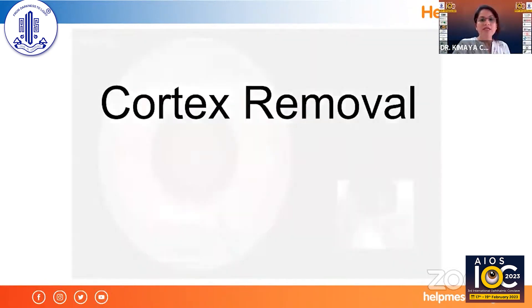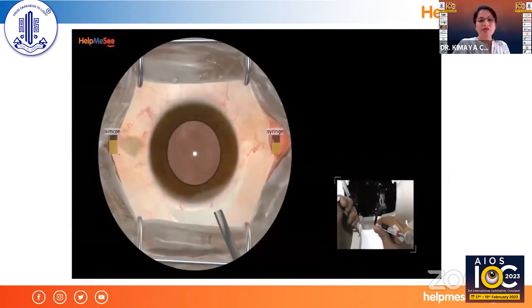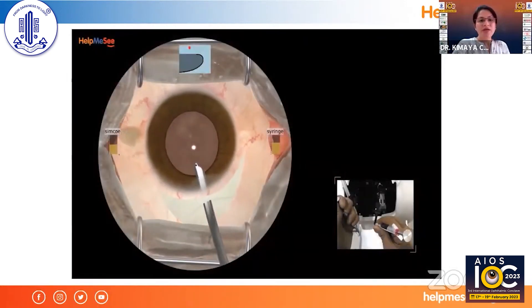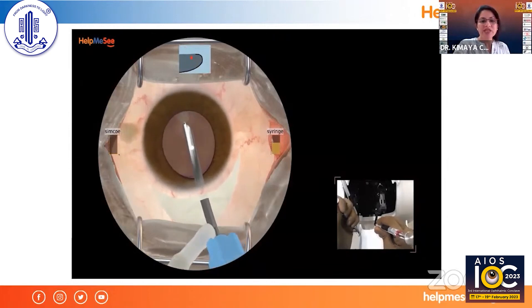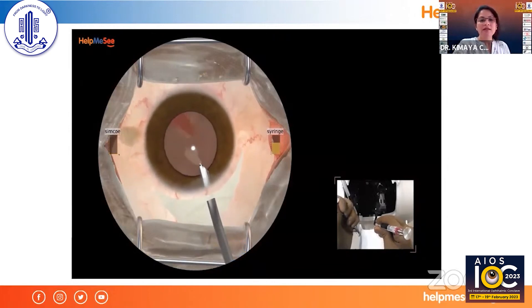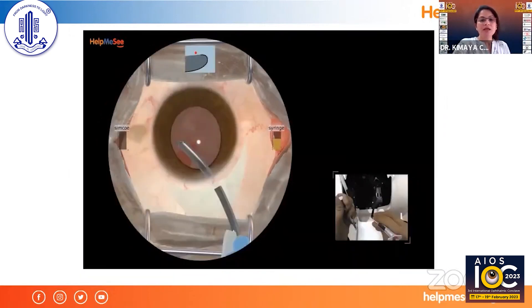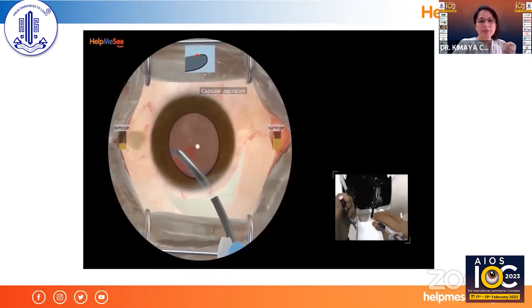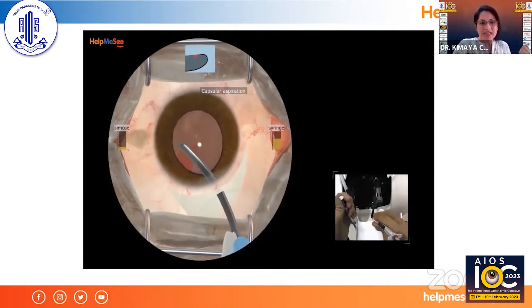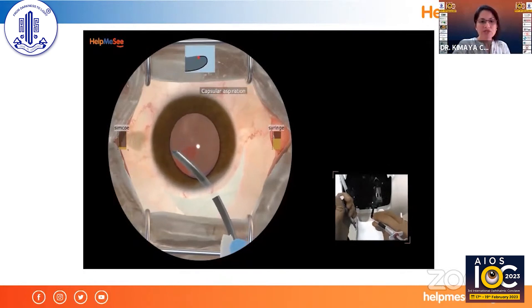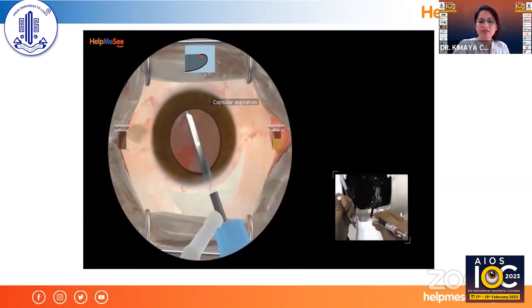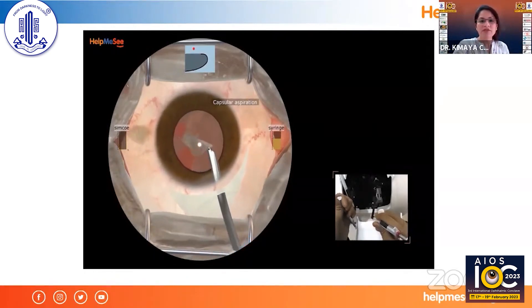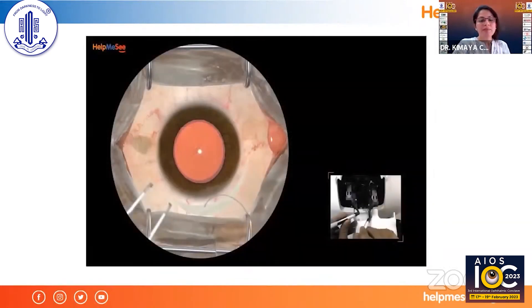For cortex aspiration, we are using simco as the instrument chosen from the desktop. If there is any inadvertent capsule capture during aspiration, the simulation will alert you to stop and re-attempt. This is all managed on the desktop.